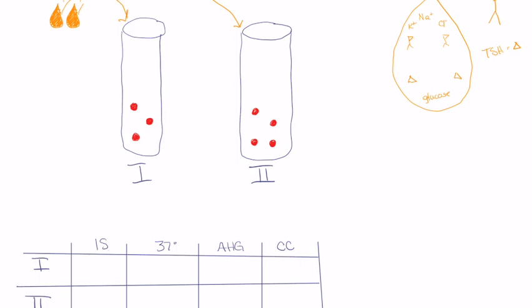And what we're specifically looking for is an antibody, let's make it this color, that's directed against someone else's red blood cell. Okay, so if this patient's been transfused or pregnant in the past, they've been exposed to someone else's blood. And when you're exposed to someone else's blood and it's different than yours, you can make antibodies to it. Okay? So that's what we're looking for in this antibody screen.